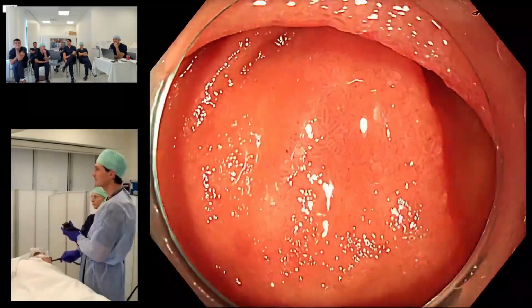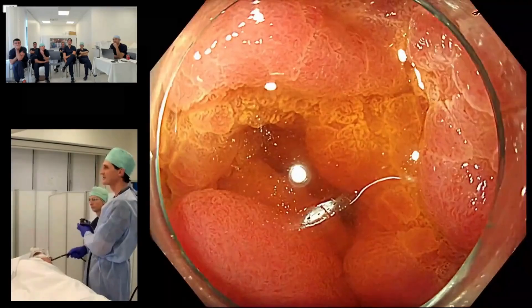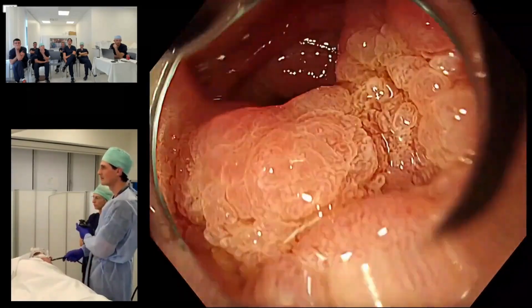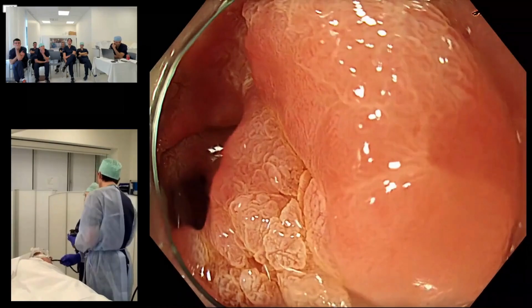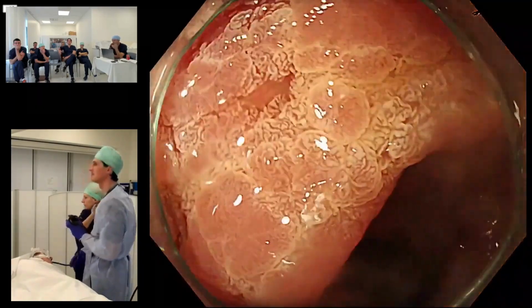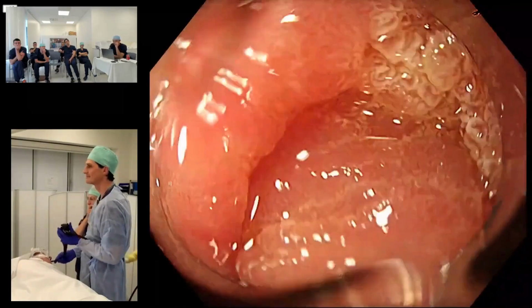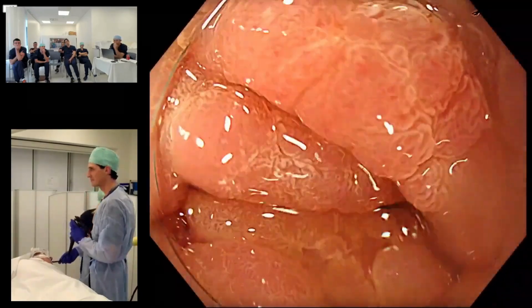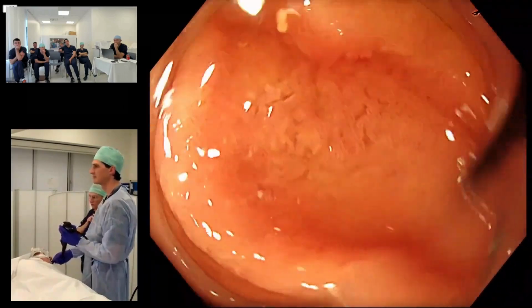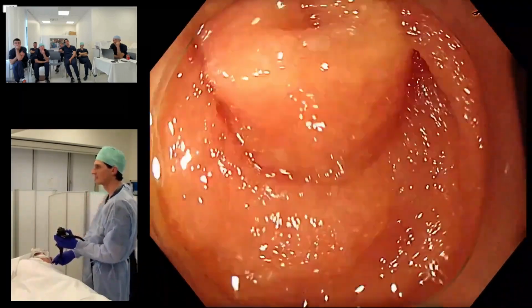He's on anticoagulants. Endoscopically, that's very important. Yeah, comorbidity and anticoagulants. I don't know, Florence, if you've got a handle on that or an idea. Yeah, he's only on Azaflow. Okay, so Azaflow is aspirin. And is there any comorbidity? No. No comorbidity. Okay. And how old is the patient? 72.